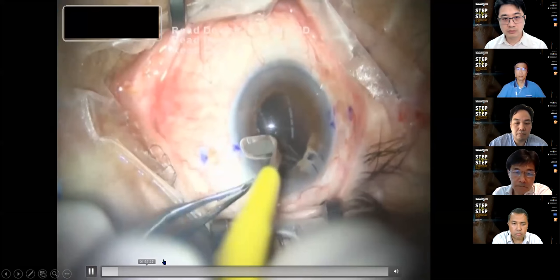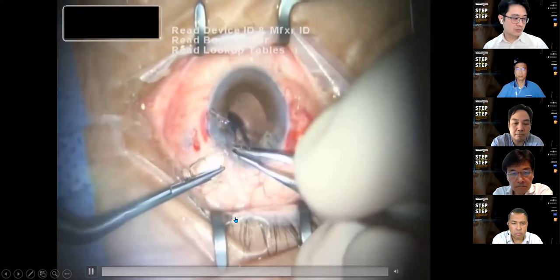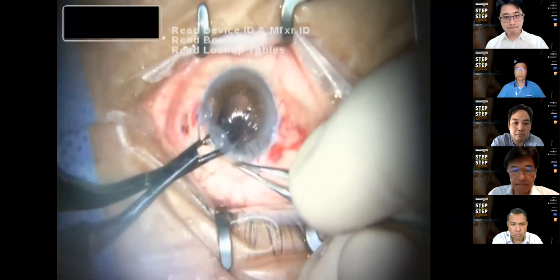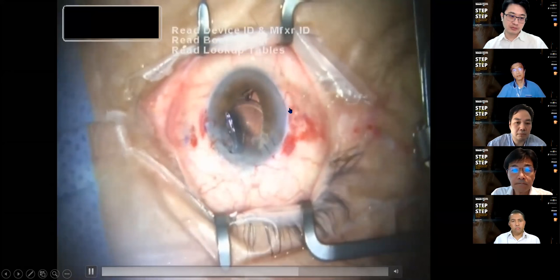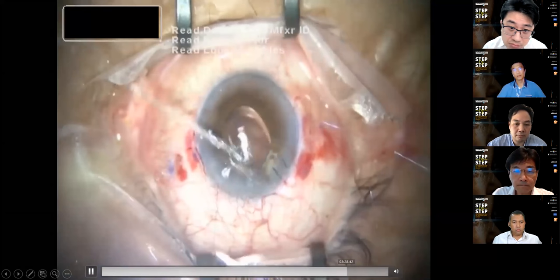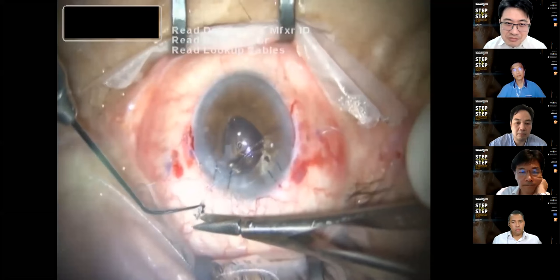Now the same thing. I think that's about all. Creating the Hoffman pocket is something that you really need. I just want to share with you, actually, this is a foldable scleral fixated IOL. The rest is all the same. It's just that you hook out the two ends of the sutures, hooking out the two suture ends and tying them together. All right, I think that's all from me.